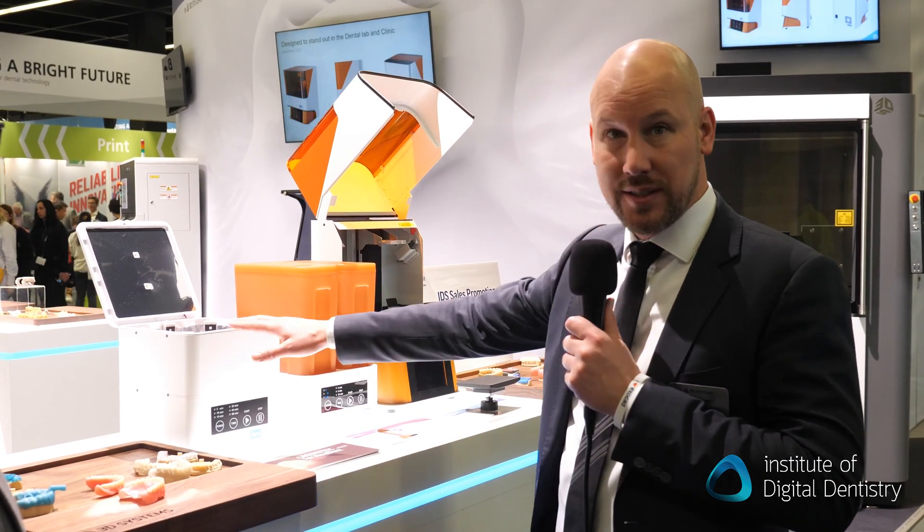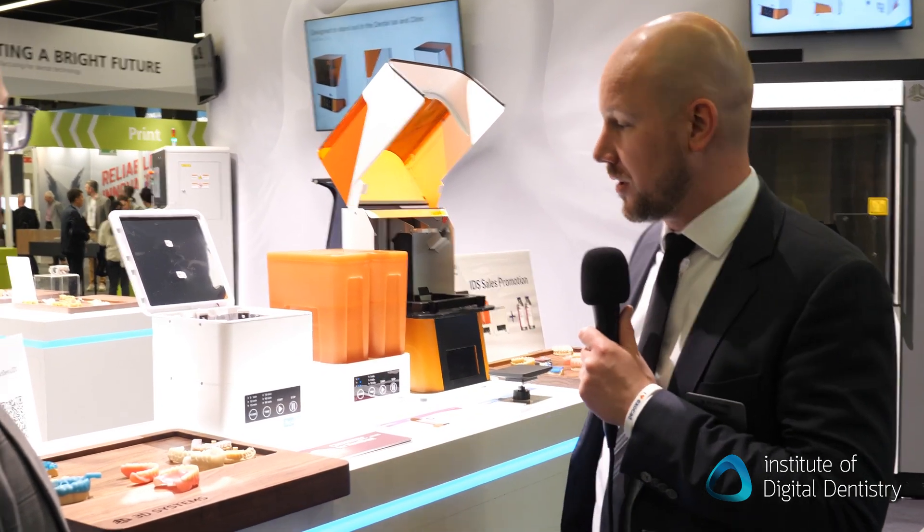A price point of about $5,500 US dollars for the printer, and $600 each for the washing device and cure box. So it's a really affordable entry-level system.